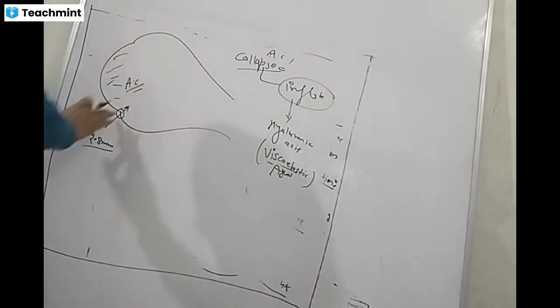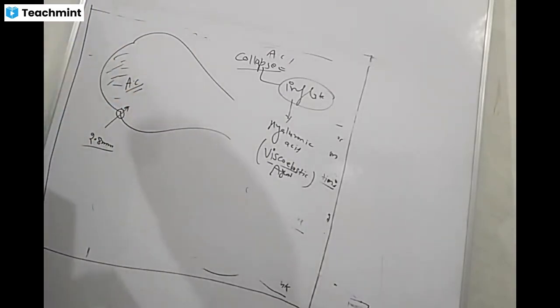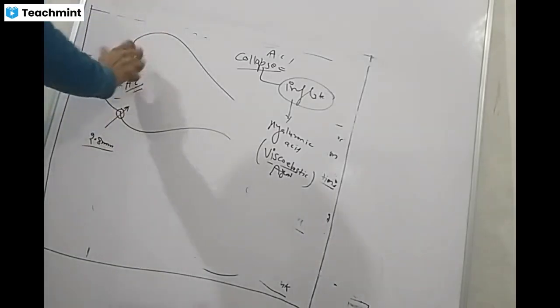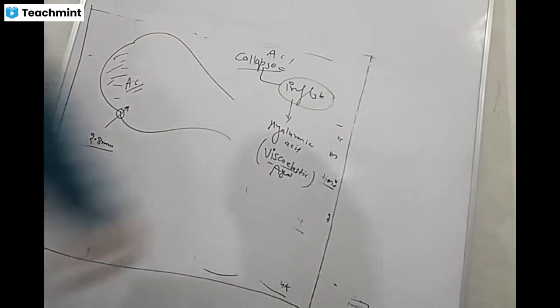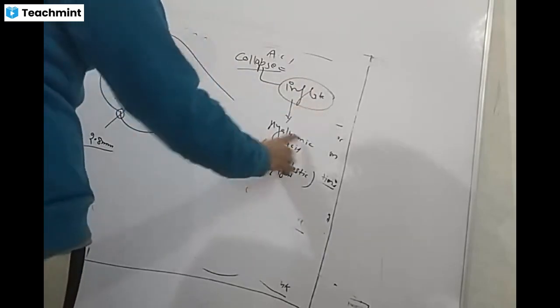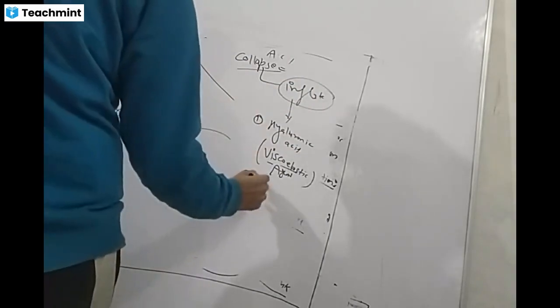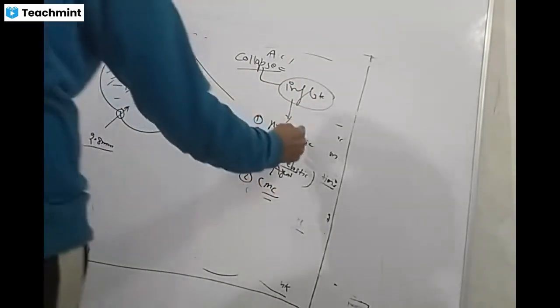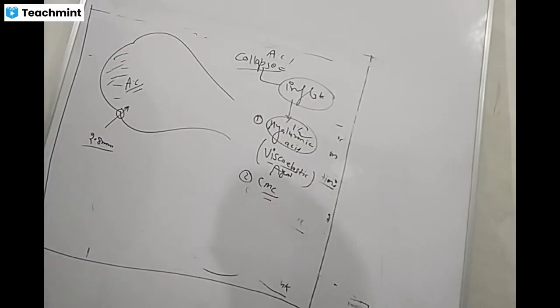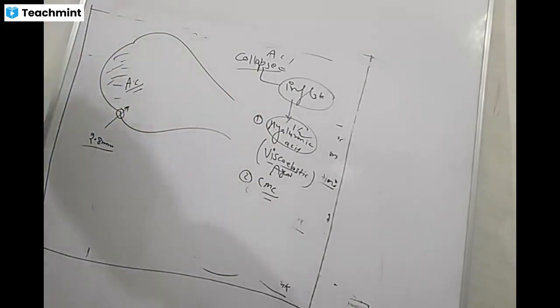So you can bring the lens material outside through the incision. It will not collapse. If you make a cut incision and the anterior chamber drains out and collapses, then it becomes difficult. So don't let your anterior chamber collapse. Keep it inflated with the help of hyaluronic acid as a viscoelastic agent, or you may use CMC, carboxymethyl cellulose. But 1% hyaluronic acid, sodium hyaluronate, is more important. So you entered and inflated your anterior chamber.